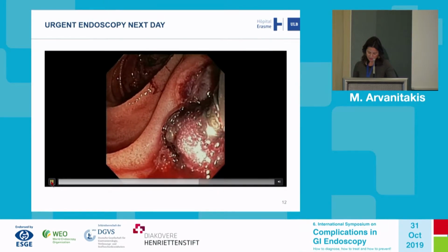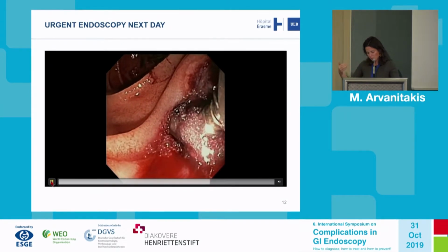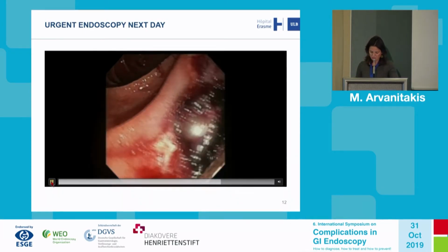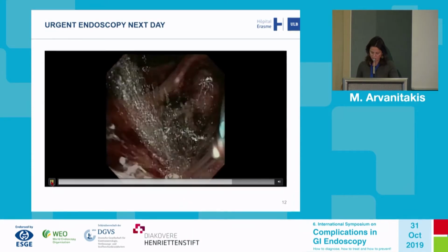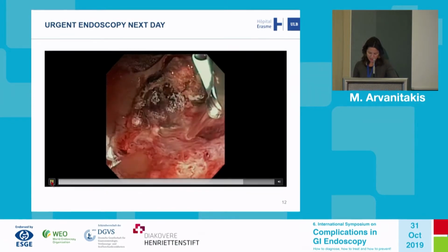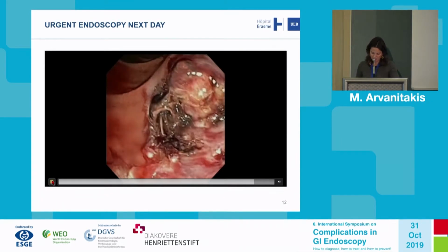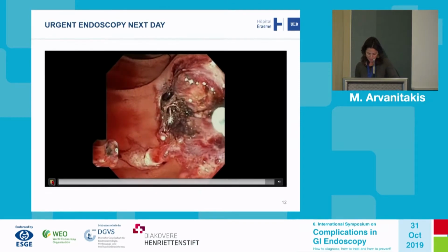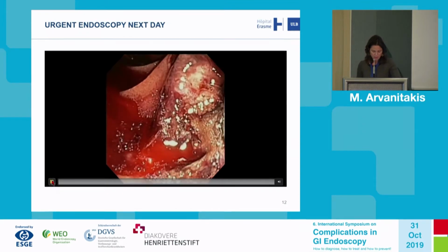This device is interesting because it's not coaptive. You don't have to put pressure in an area where there's just been a resection. You want to avoid perforation. So this is a good device to treat bleeding after ampulectomy, and people that do ESDs know this device very well, of course, and it was useful in this case. As you see, the pancreatic orifice is identified nicely on the right here, and there's no more bleeding. So that finished well at this point.